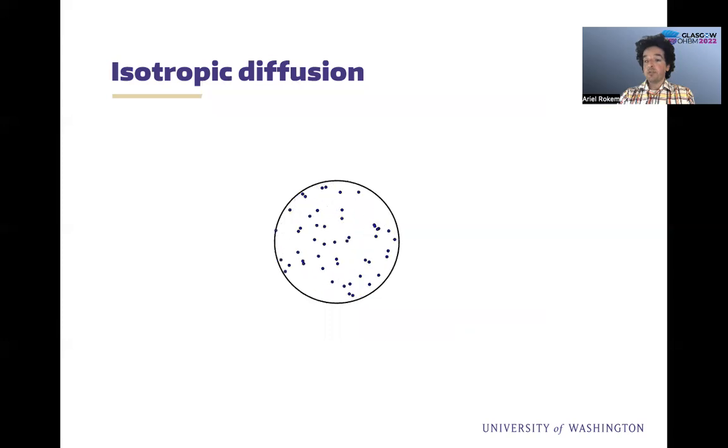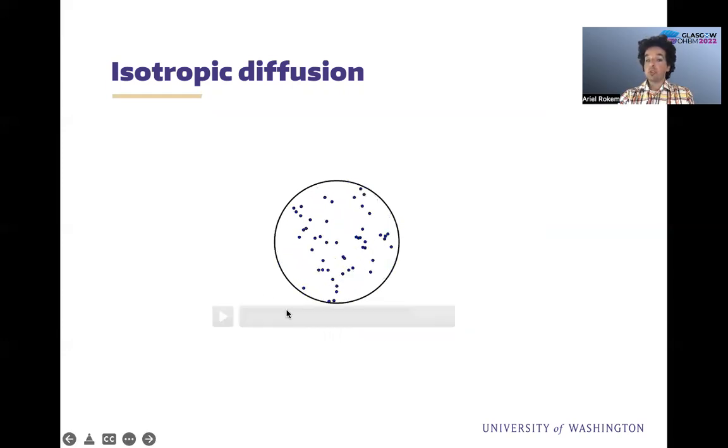Diffusion MRI takes advantage of the properties of water inside of the tissue, and primarily of the fact that in some places, diffusion of water, the random motion of water molecules, is isotropic. In particular, in parts of the brain where restriction of the water in all directions is similar, such as in the ventricles, where the water can diffuse freely in all directions, or in round compartments inside of the brain, diffusion is isotropic.